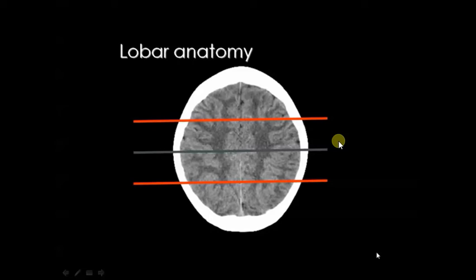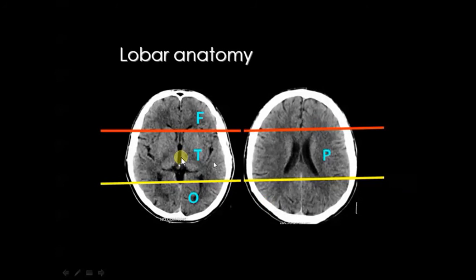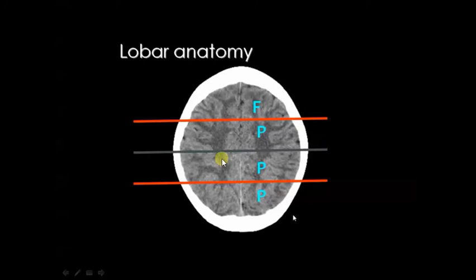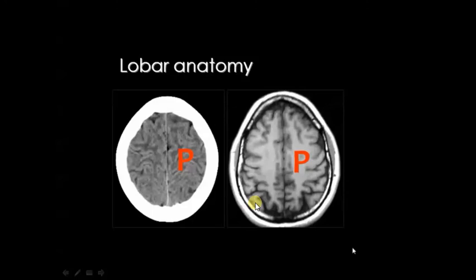If you divide the area this way, you can find the frontal area — it is called the frontal lobe — and the rest of the area is only the parietal lobe. Why not occipital lobe? Because the occipital lobe is very small, so it lies only in the third ventricle level area. Above the lateral ventricle area you can find only the frontal lobe and the parietal lobe, and if you go more above that — the vertex area — you can find only the parietal lobe. There is nothing else: no frontal lobe, no temporal lobe, no occipital lobe.